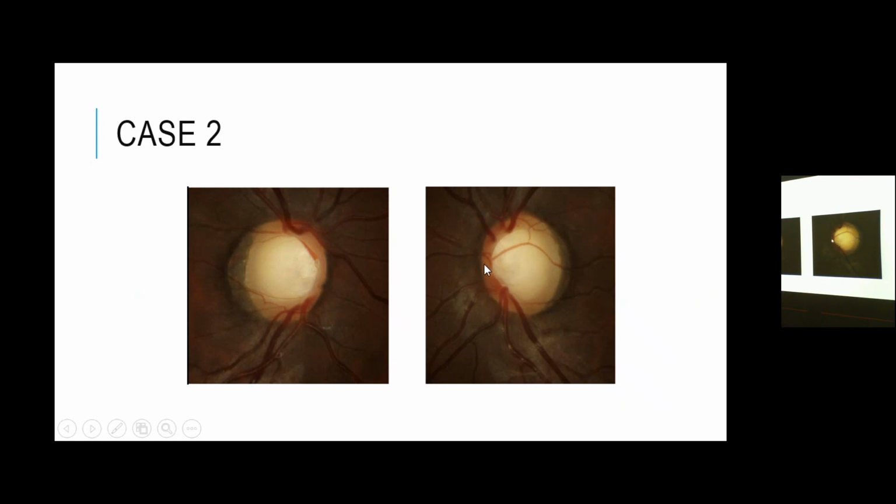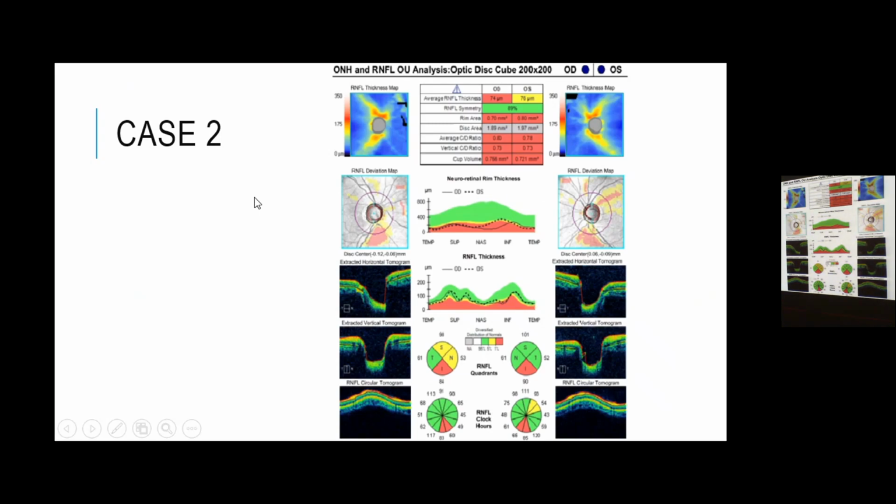Could this be glaucoma? Could be. There's no other finding other than the larger cupping. So you do OCT and this is the result. What do you think about it?